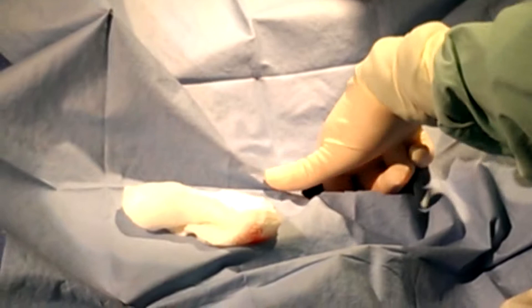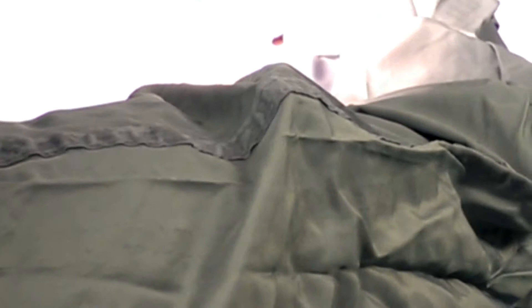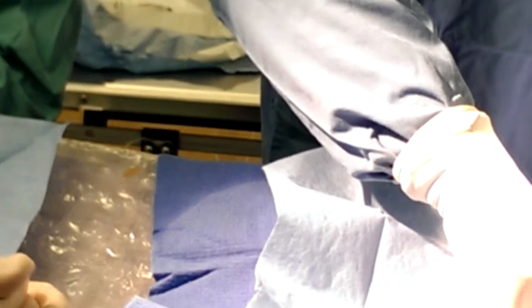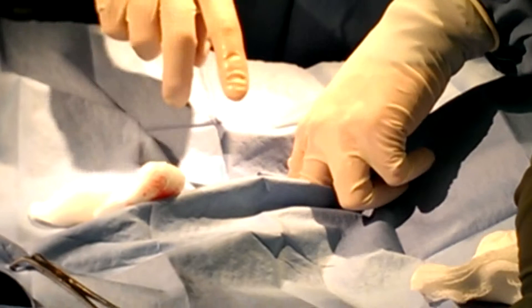If her heart rate starts to drop, her respiration starts to drop, she may be getting cold at that point — let him know and turn down the anesthesia a little bit. This dog's spleen was probably not this big before we gave the ace. The next group needs to be able to get in here, so pick up the clutter.